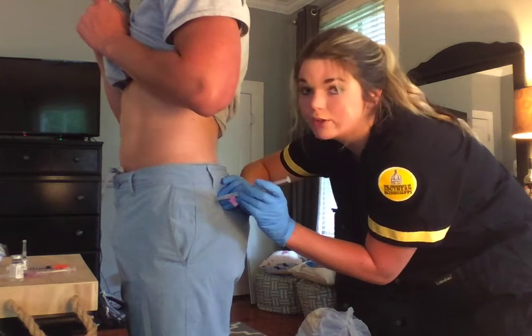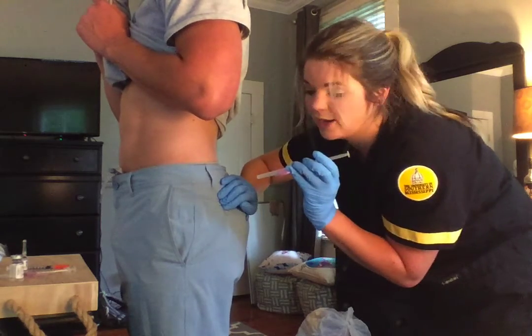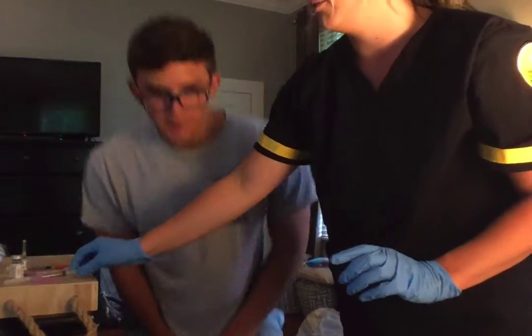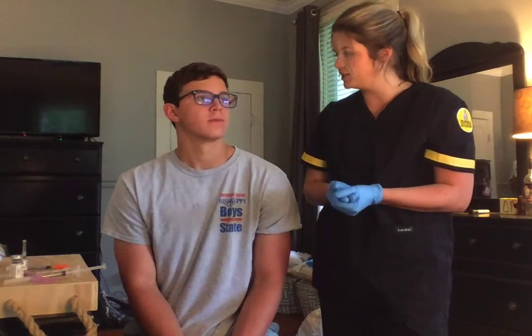It's in. I will aspirate to make sure that there is no blood, and there's not. So I will push it in, and then I will take it out. And I will let go of the skin and let it go back. You can sit down now. I use the Z-Track method just to make sure that no medication comes out after I pull the needle out. And now you have been given your injections and you're good to go. Thank you.